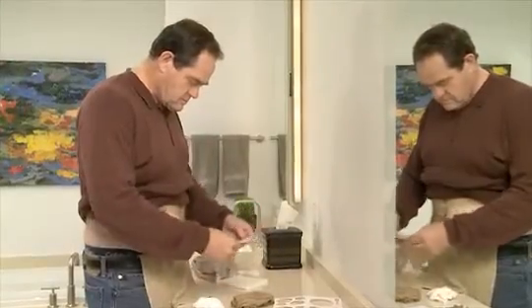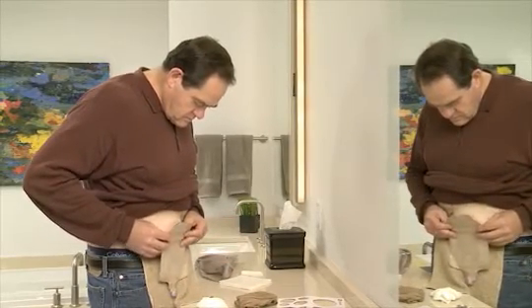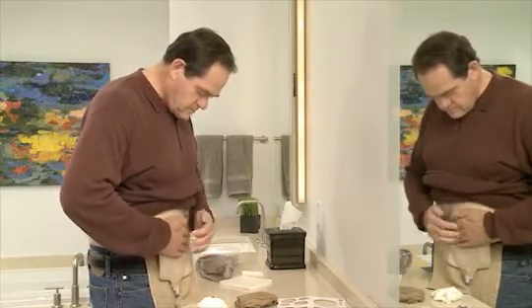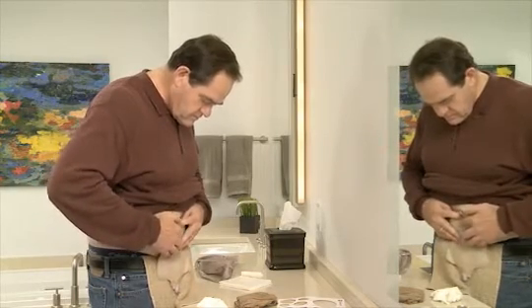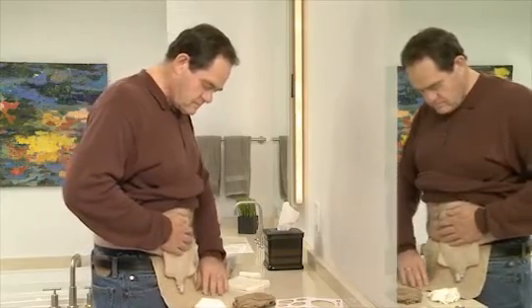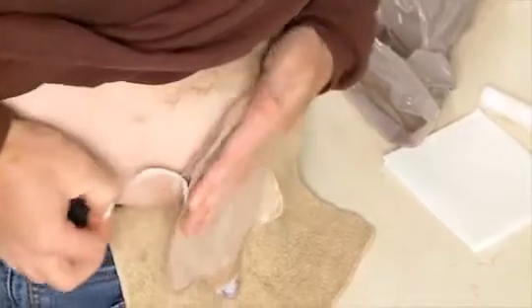Finally, put the pouch on by first centering the opening over your stoma. Gently press the barrier to ensure it makes good contact with your skin, beginning next to your stoma and working out toward the edges. Place your hand over the barrier and hold it in place for about 30 to 60 seconds. The warmth of your hand and gentle pressure will help to activate the adhesive.